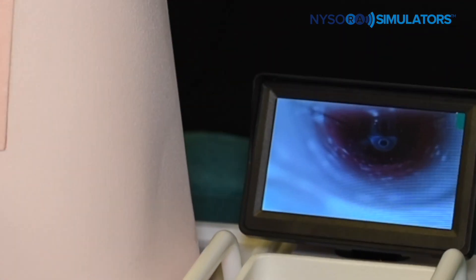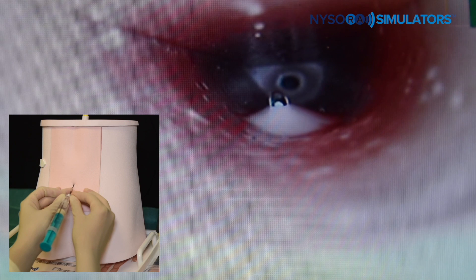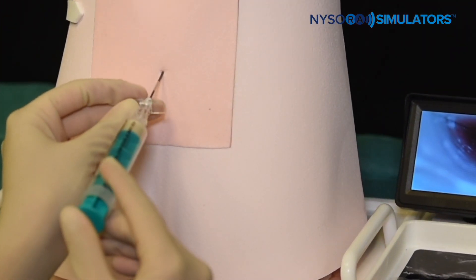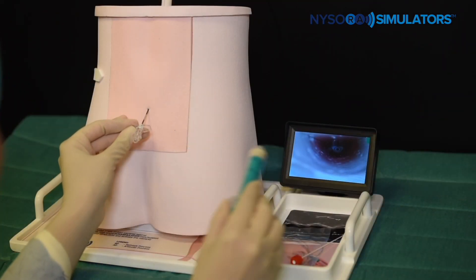As the needle is advanced, it encounters resistance because it is located in the ligament. As the needle exits the interspinous ligament and enters the epidural space, a sudden loss of resistance to air is perceived, which signifies proper placement in the epidural space.